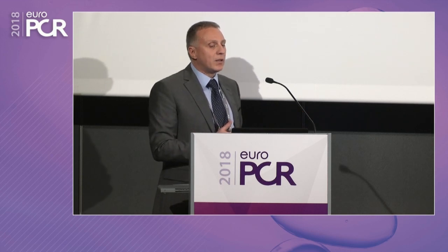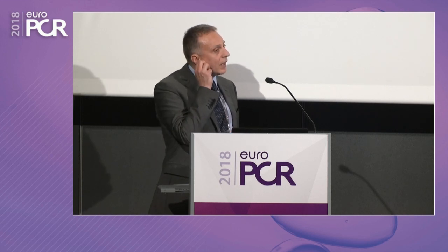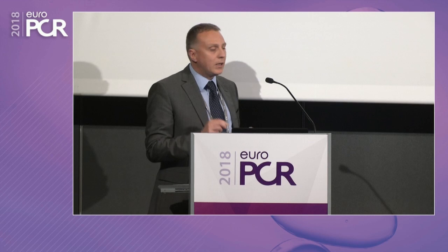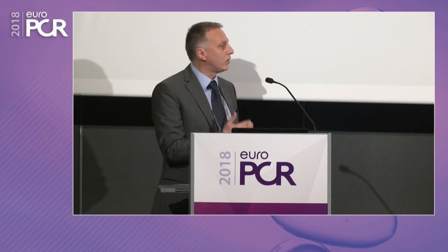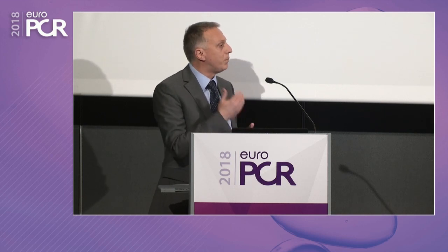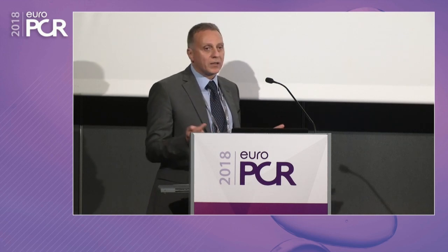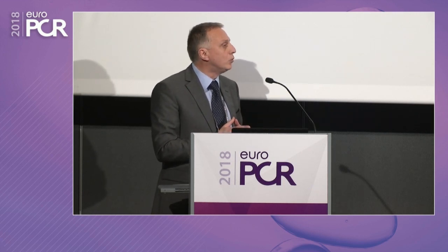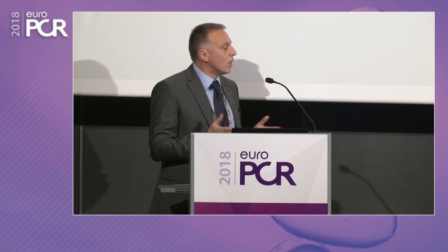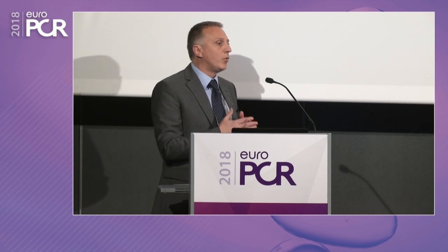When you look at the result for the more complex techniques, you may see that if everything goes well, you may have a really fantastic result at the end. The problem is that in each step of this complex technique, there is the possibility of pitfalls. Even with just one rewiring, which is required for kissing balloon inflation, you need to go into the distal cell to have this fantastic result. If you go proximal, you do not even remove the stent struts from there. So when you go into the more complex steps, you increase the possibility of errors.